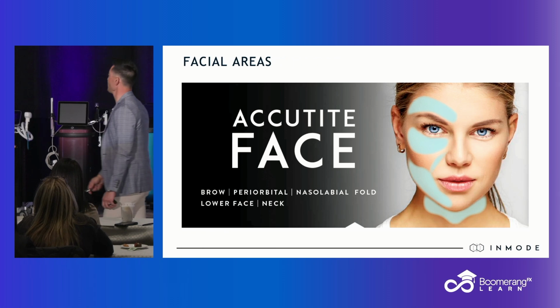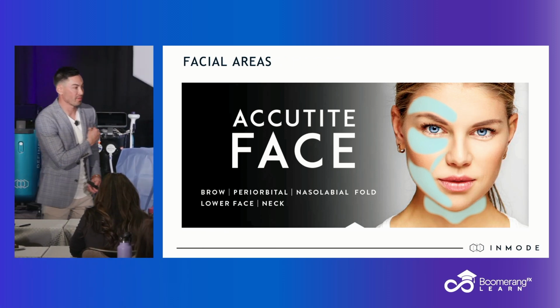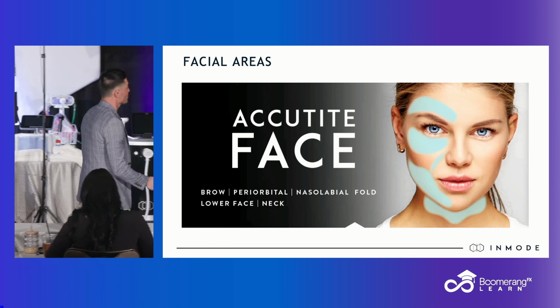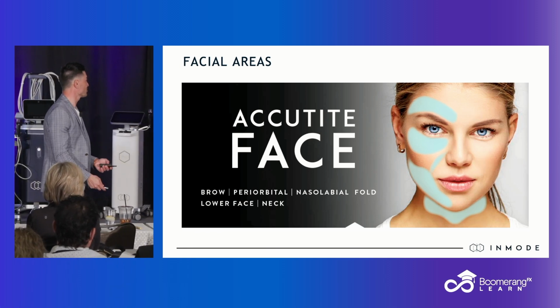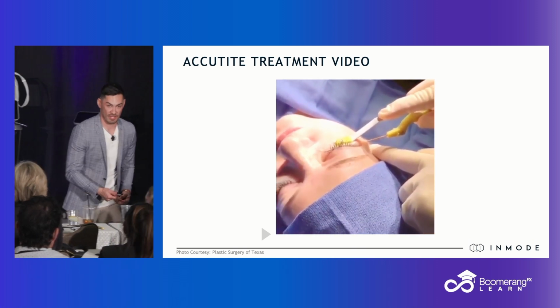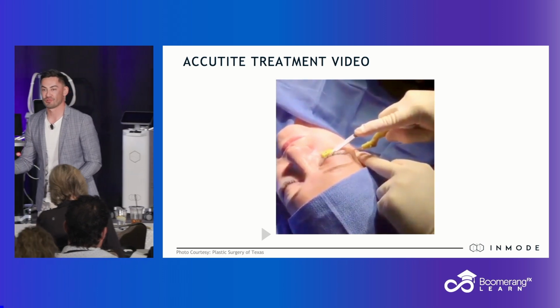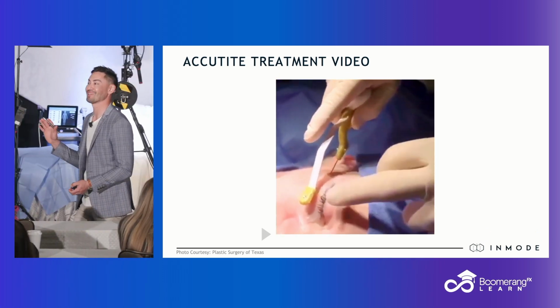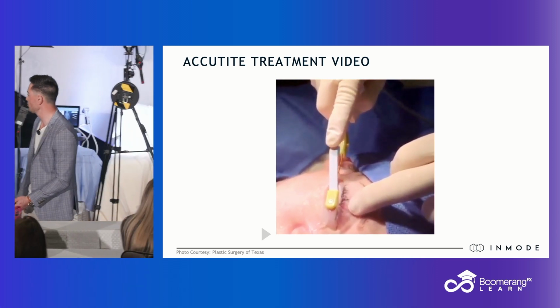Same rules apply that we've been talking about. This is the proposed areas, although we can take that AccuTite and I can use it on our armpit roll. I can use it on the top of a knee. So these are the areas that InMode has been toying with, the brow, periorbital, nasolabial. Here's what I would say. You can do periorbital. I wouldn't start there, but yes, you can absolutely do lower lid. There's a lot of high-priced real estate there. If you're not doing lower blephs, I would suggest maybe start in a less high-priced real estate area like submental, before we just jump to that. Or nasolabial fold's a good one.